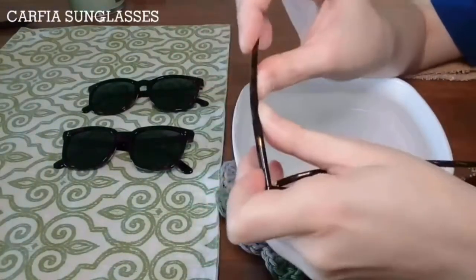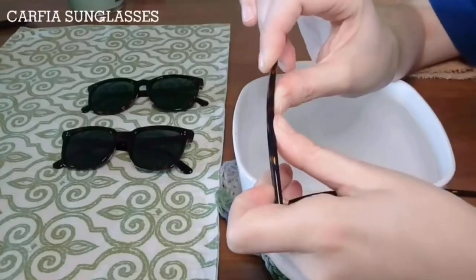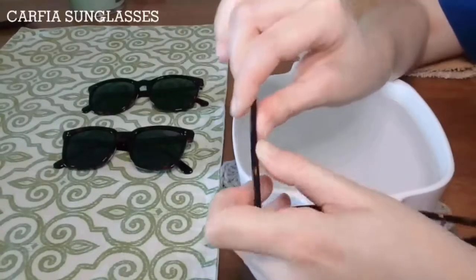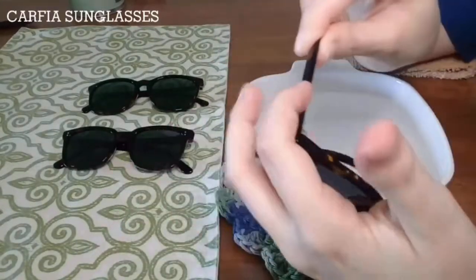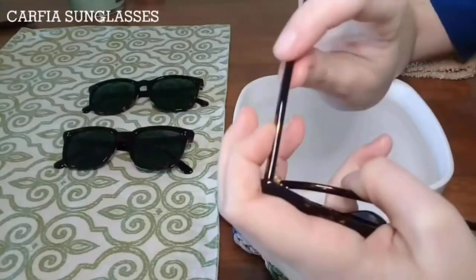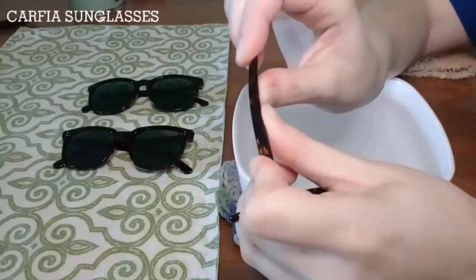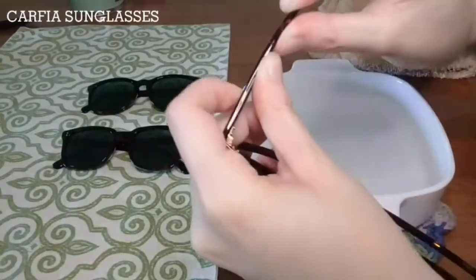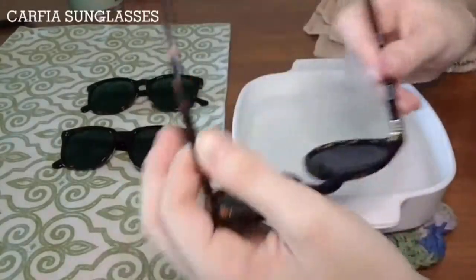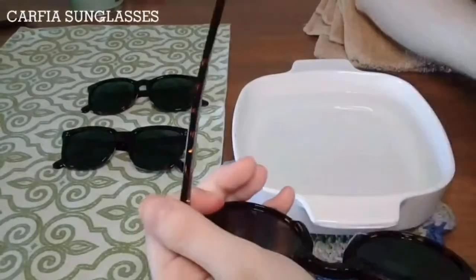I'm going to continue to go with that. Likewise, if the hinge is making any noise, or you see the hinge start to move in a way that it's not supposed to, then definitely discontinue that. But as long as you're using your index finger to kind of hold the place on the outside, right outside of the hinge, this really helps support that part, and you're not actually putting too much stress on the hinge this way. So I've pushed this out now, and as you can see, it has quite a bit more curvature than the other side does.